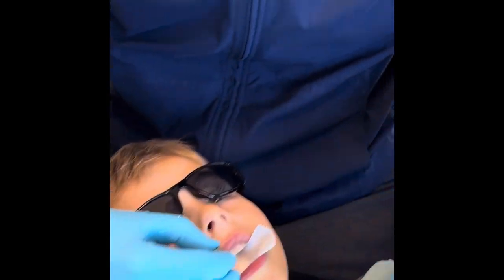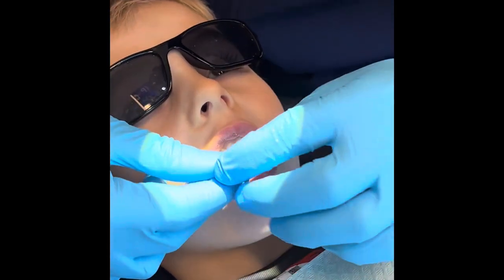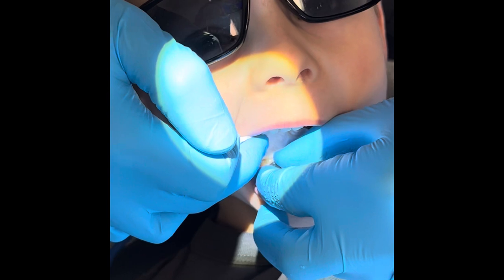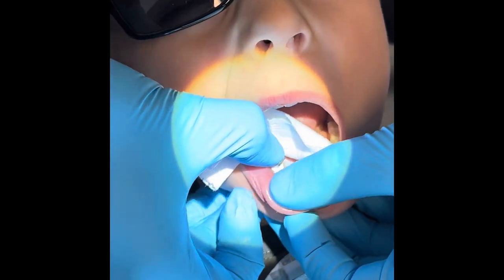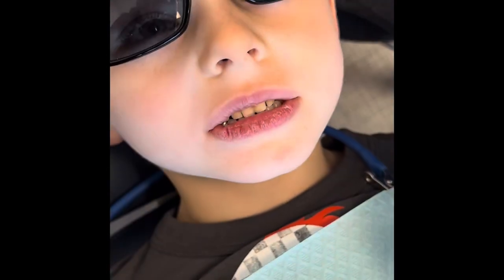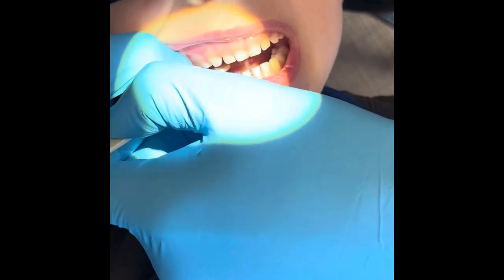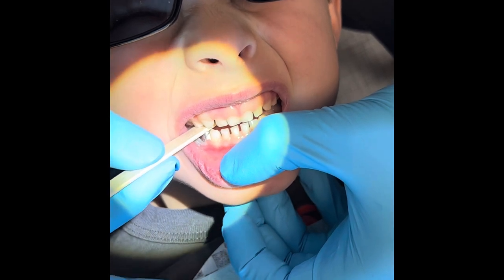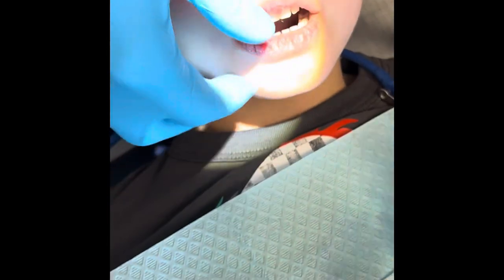Open really big — we're gonna cement this in. Open as big as you can, James. We put it on, I push, it's a big push, and I wipe some off. This is where I need you to help me — we have our popsicle stick. Open big and bite as hard as you can, try to break that stick. Harder, harder! Nice job. Open big, good, and then we'll wipe it.